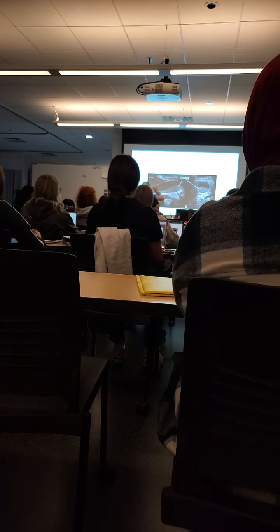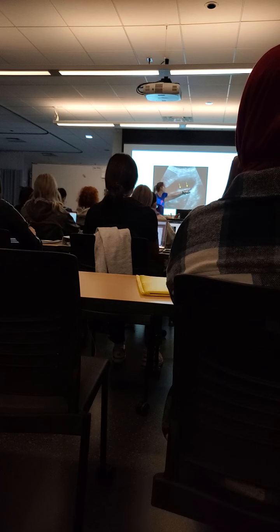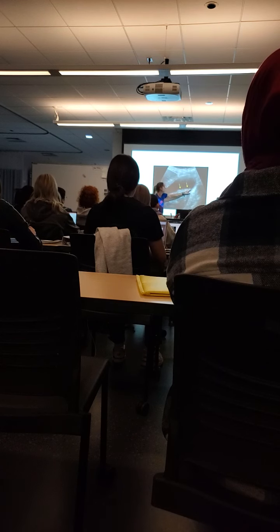So here we are in sagittal. Here's our typical bile. Here's our whole gallbladder right in here. And then we have this kind of sludge accumulation in the dependent portion. As we roll this patient, that sludge is going to continue to roll to that more dependent portion. Here's another little accumulation in the fundal portion, the body of the fundus.